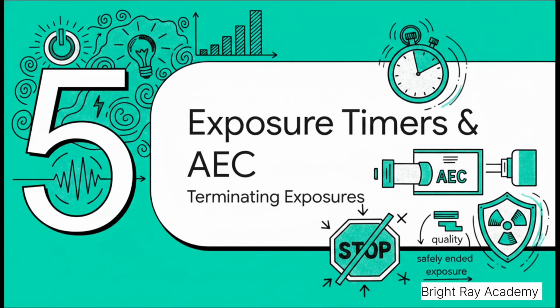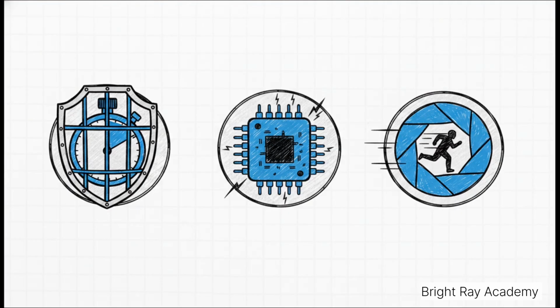And finally, Section 5, Exposure Timers and AEC. So the timing circuit is actually completely separate from the other main circuits, and it usually operates on the safer primary side of the high-voltage transformer. First off, there is a built-in safety net called a guard timer. This will forcefully terminate any exposure after about 6 seconds, just ensuring you can literally never accidentally irradiate a patient continuously.